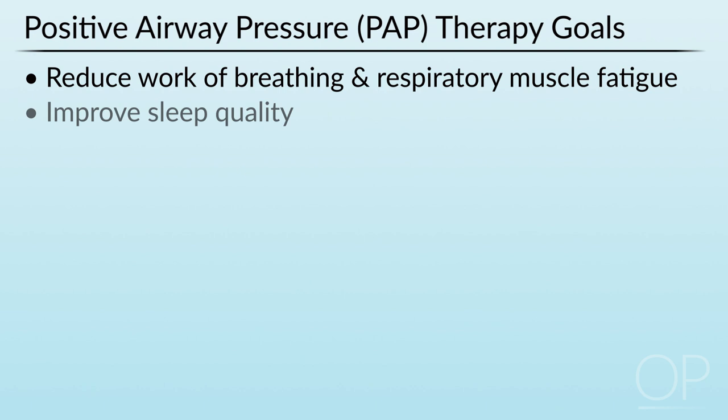It improves the sleep quality. We learned in the previous slide that disordered breathing can cause significant sleep fragmentation. And because of the poor sleep they get, they tend to have significant daytime symptoms. Hence, by giving them a stable airway, stable respiration, you can stabilize their sleep and hence you can treat their daytime symptoms of sleepiness, tiredness, and fatigue.